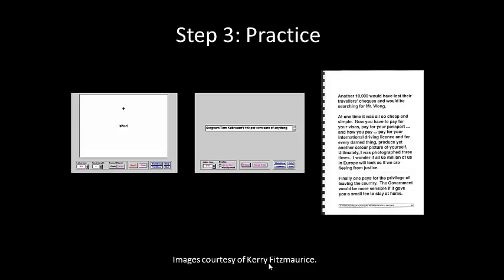And you can see there the different types of practice opportunities that are shown through the ECView modules, the left side and also in the middle. In the middle is a sentence, and you can increase the complexity by increasing how many lines you actually are showing to the patient at any one time.